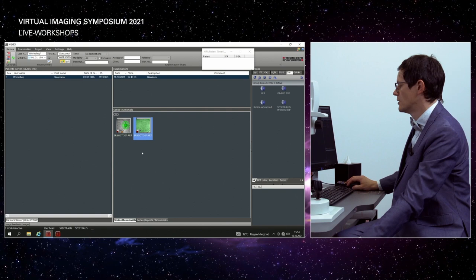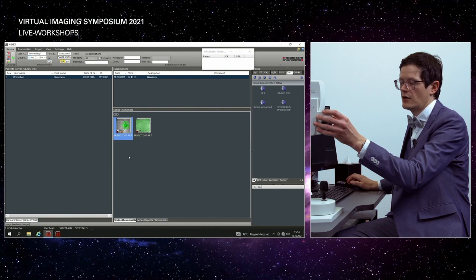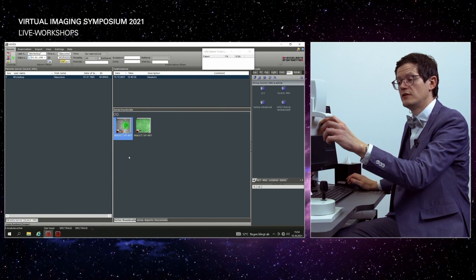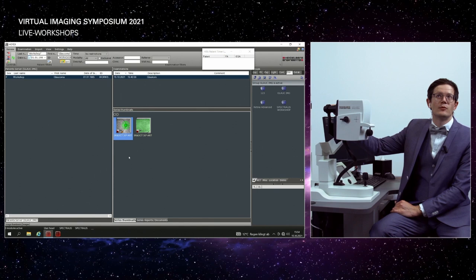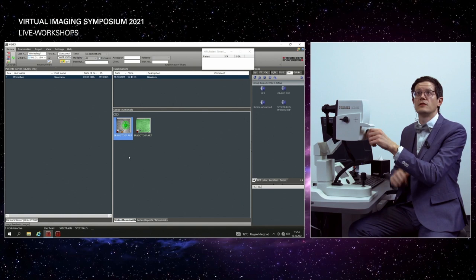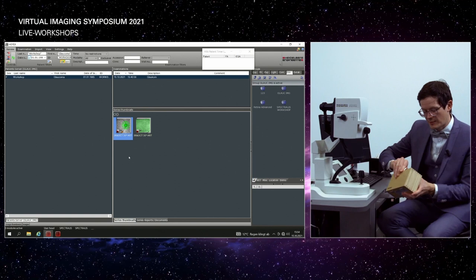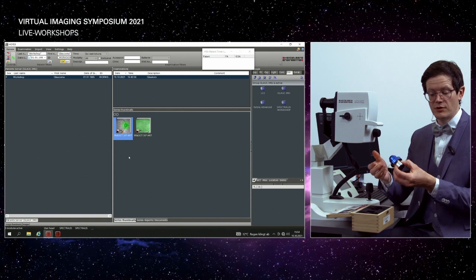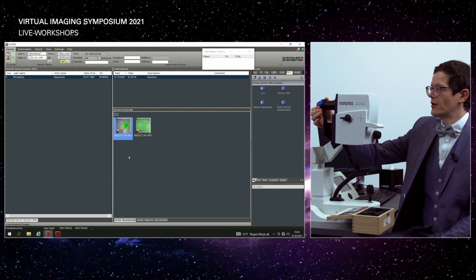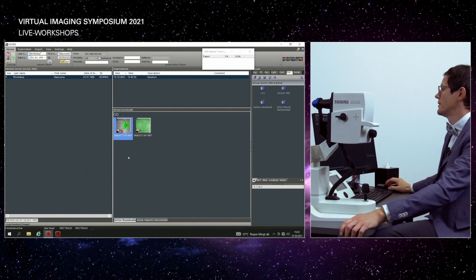Before starting the analysis, I want to show an additional measurement. I adjust the focus knob to create more space, then switch to the anterior segment module. The anterior segment module comes in a wooden box — I take off the 30-degree lens and take out the blue lens, which is always the anterior segment module lens. It has a red dot like all our lenses. I then go back into the examination to continue.